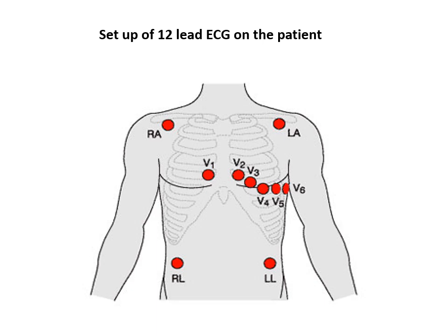So this next slide is showing the general setup for an electrocardiogram. So what is an electrocardiogram? It's basically the electrical activity of the heart that's then translated onto a piece of paper, and we view it in 12 different positions. So 12 leads. So we'll get a readout of 12 different positions on an ECG.